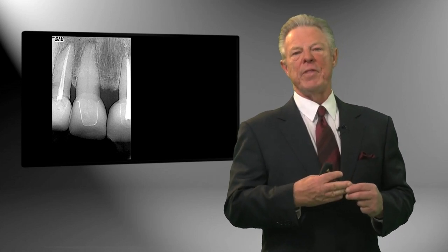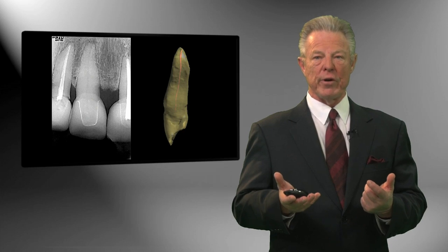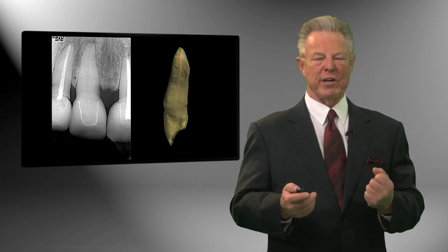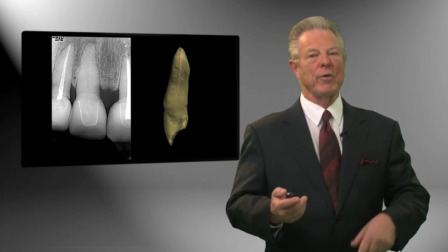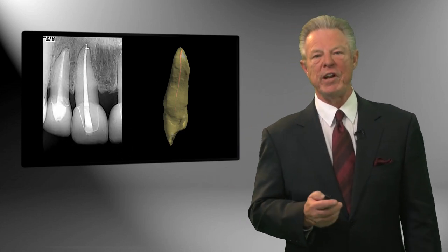This central incisor, you can imagine that was a non-vital pulp. The end of the canal is bigger than the incisal part. Pulps die and calcify crown down. And so what we want to do, the last principle of Schilder, is to leave the foramen as small as is practical. We can't make it smaller. We discover, like in the tooth atlas, that it's a 30 or 40 apically, and yet in the top part it's restrictive dentin. Hence the following and the brushing and the let it run and paint and let it run and paint. And here's the finish, 2 different views.